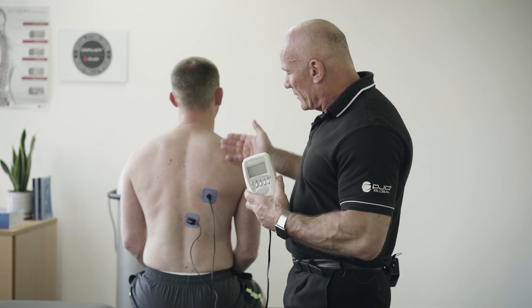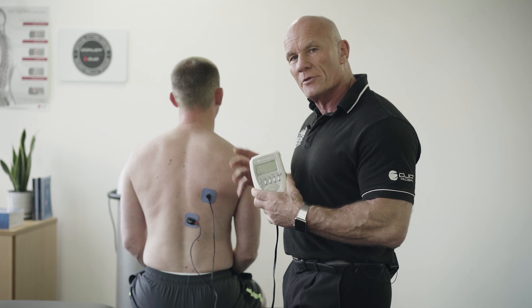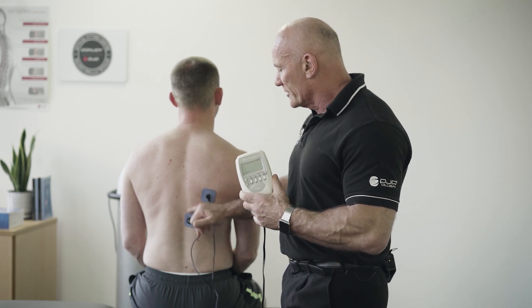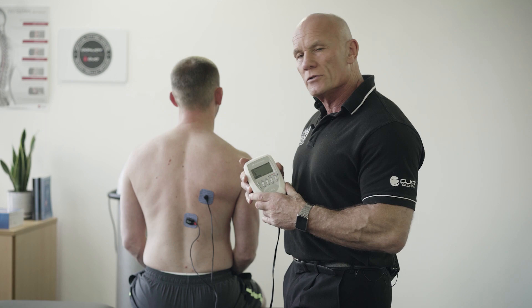The patient is learning the correct way to fire this stability muscle, but I'm not giving any instruction because I want him to learn this in the subconscious part of the brain. Then I can progress this movement on to adding in mobilization exercises to the shoulder.